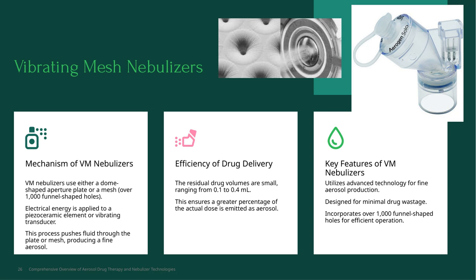These devices utilize either a dome-shaped aperture plate or a mesh with over 1,000 funnel-shaped holes. When electrical energy is applied, it activates a piezoceramic element or a vibrating transducer. This vibration pushes the fluid through the plate or mesh, creating a fine aerosol that can be easily inhaled.